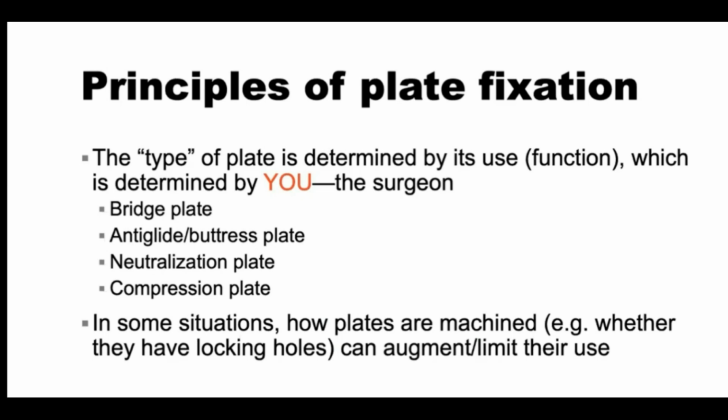So this is not something where you say I'd like a bridge plate and you whip the bridge plate out of the box. This is something where you, as an orthopedic surgeon, will learn to take a plate and say, what can I do with this? And how do I want this plate to be used based on what kind of function you want it to perform? And then it takes on the identity of the type of plate that it's becoming.